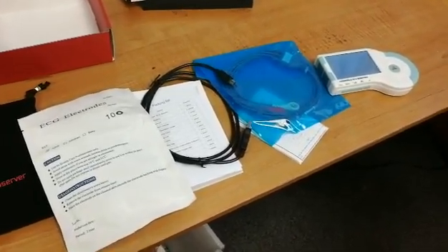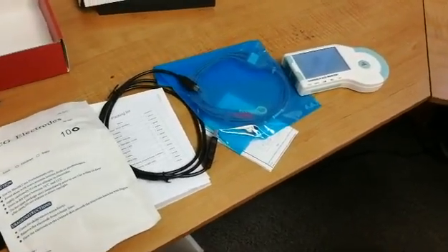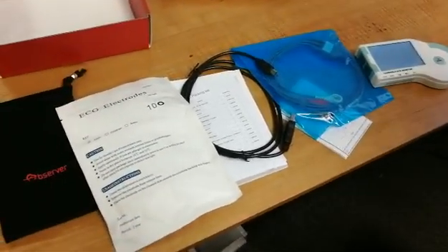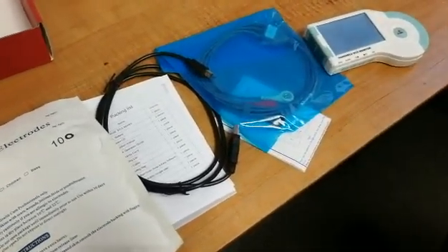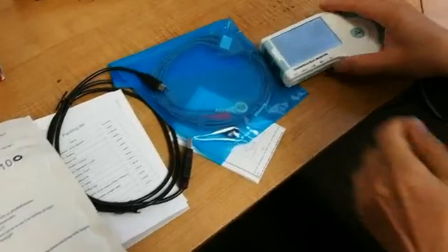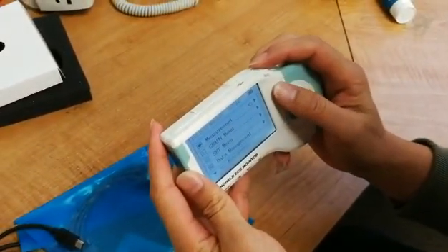ECG cables, as well as the unit itself. The ECG cables and ECG electrodes are optional, as this item is cable-free. To give a quick review on how to use the item, please hold down the power button at the top.